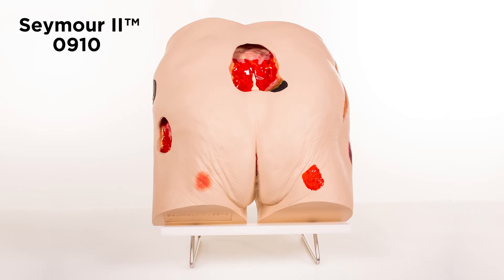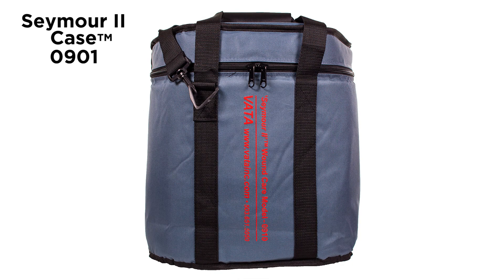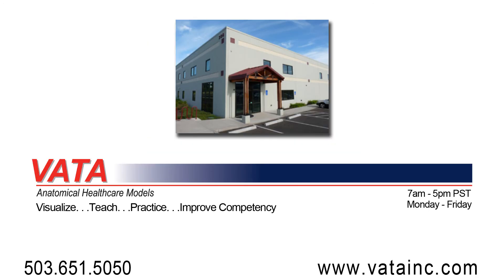The Seymour II wound care model is available in lightly pigmented and darkly pigmented colors, and an optional carrying case, model 0901, is also available.